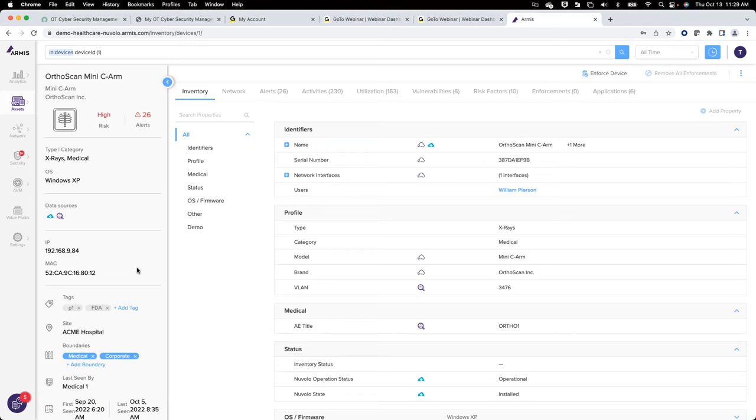And even as Arshad alluded to, there's going to be certain work that's performed by IT. A good portion of the time, that's not us. And so how do we transition that information, whether it is leveraging a tool that's going to talk to Cisco ICE to ultimately start that ACL process for the changes that are necessary, that's one option. If it requires actual IT boots on the ground, to my definition earlier, if it's beyond the wall, then maybe we need to issue an alert. And a lot of times that's going to be facilitated really through Armis rather than Nuvolo. You know what I mean?